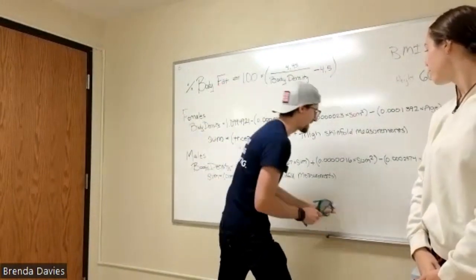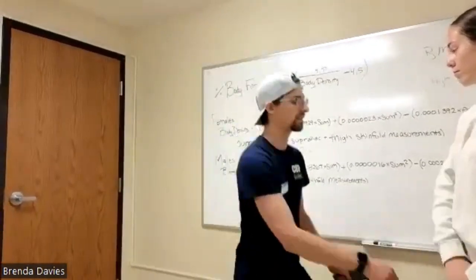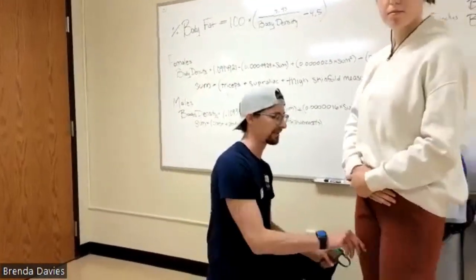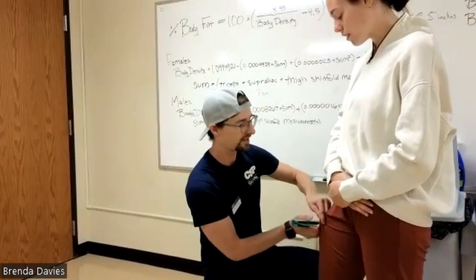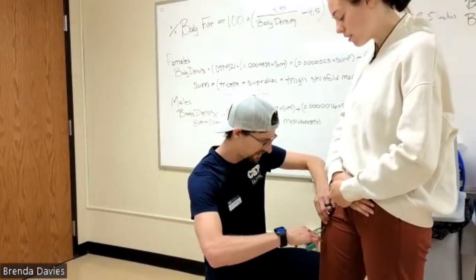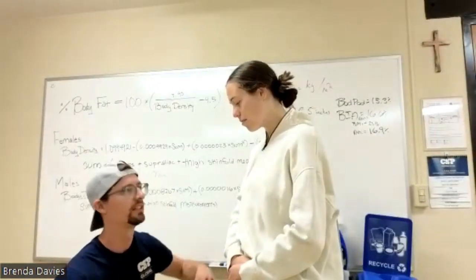And then the thigh is the last one. This one's a little bit difficult, especially if you're wearing pants. That's fine. You can still do it. What I'll do is, I don't know if you can see this. My camera's not following me well. But what I'm going to do is I'm going to measure the thickness of this as like a 2-ply piece. And then I'll subtract that off. So that is, because it's really thin, it's 1 millimeter, which is great.